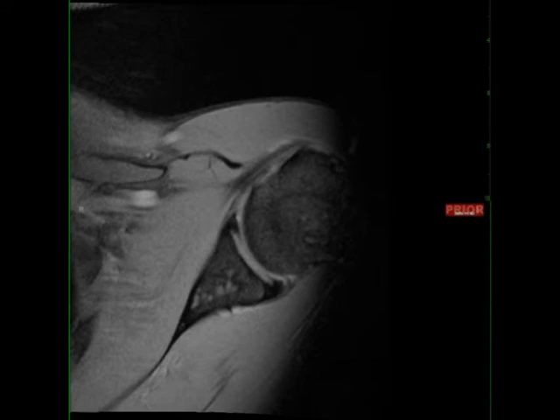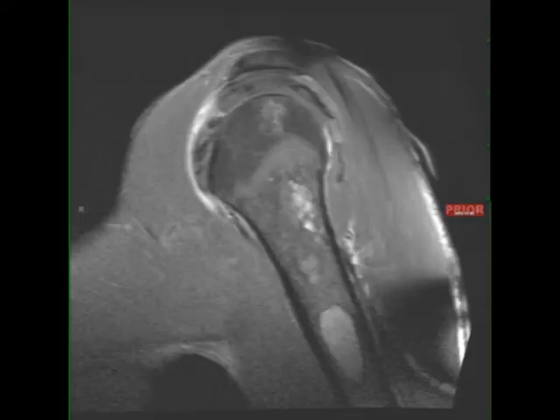The lesions are T2-STIR hyper-intense and heterogeneously enhanced. Additional lesions were identified in the left 5th through 7th ribs laterally, where there was associated osseous expansion. There is also involvement of the orbital roof on the left.